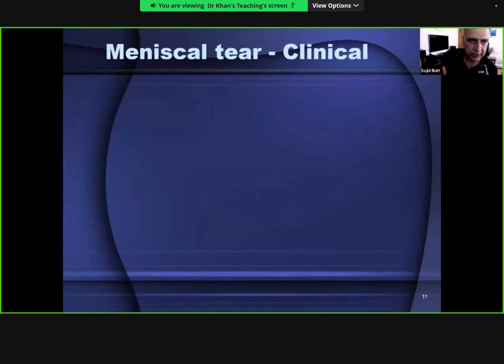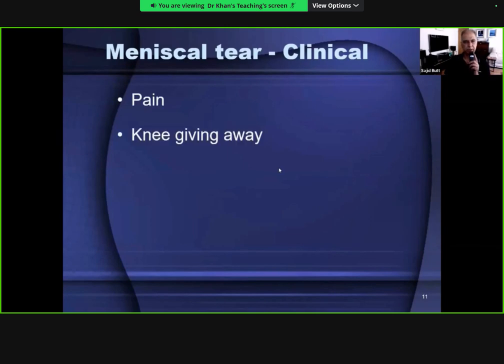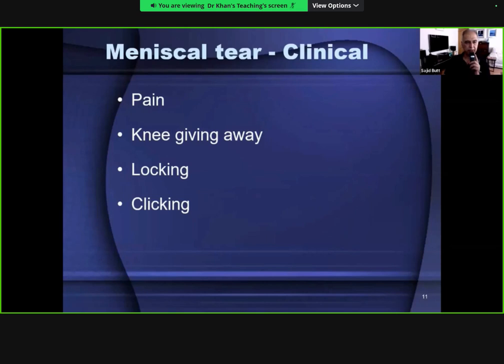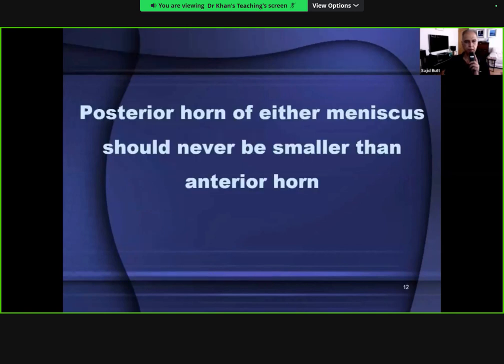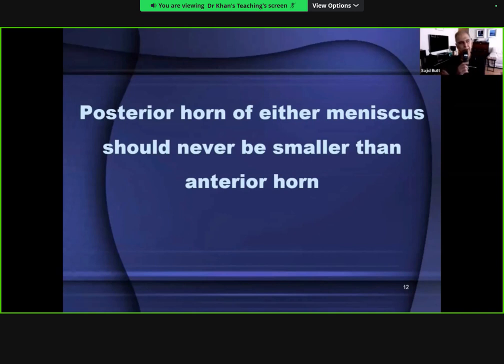Clinically, patients with meniscal tears present with pain, symptoms of knee giving way, locking, clicking when walking, and limping, with or without soft tissue swelling. Importantly, the posterior horn of either meniscus should never be smaller than the anterior horn. In the medial meniscus the posterior horn is larger; in the lateral meniscus they are equal. If the posterior horn of any meniscus is smaller than the anterior horn, that indicates a tear.